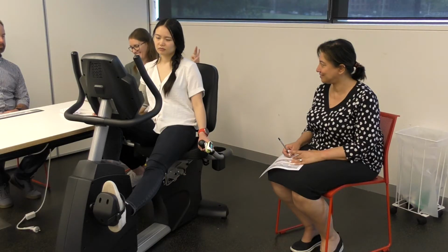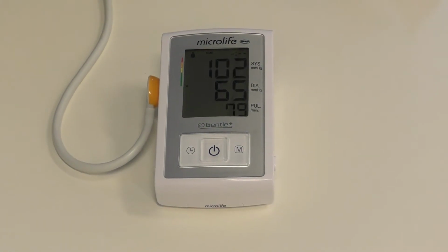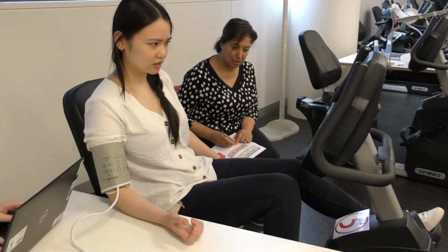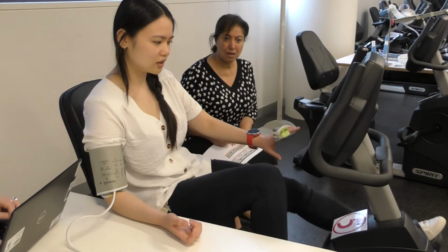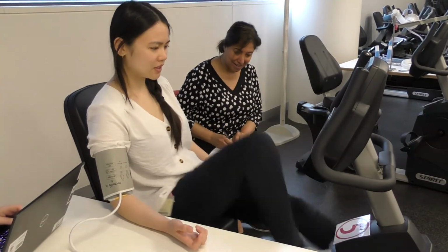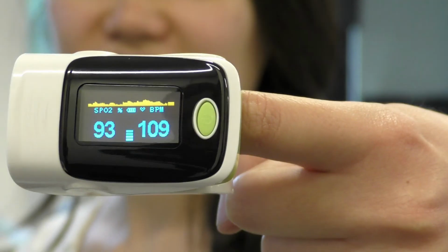When everything is ready, we'll start the clock, and in the final minute of that 5-minute period, we will measure blood pressure. And you can see here that the final number is 102/65 at rest. Once we have that, we will start cycling as we did last week and start the first pedaling at 25 watts. And we'll be recording heart rate every 5 seconds in that first minute at the commencement of exercise.